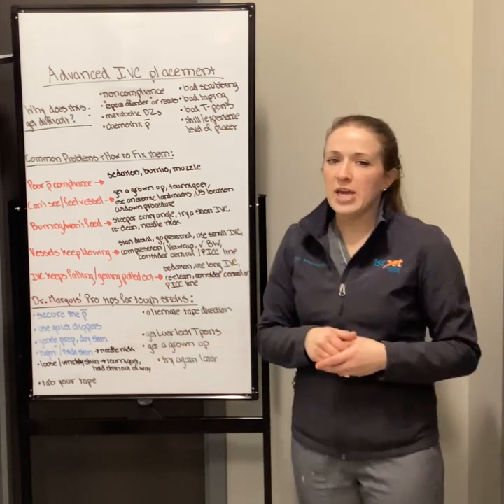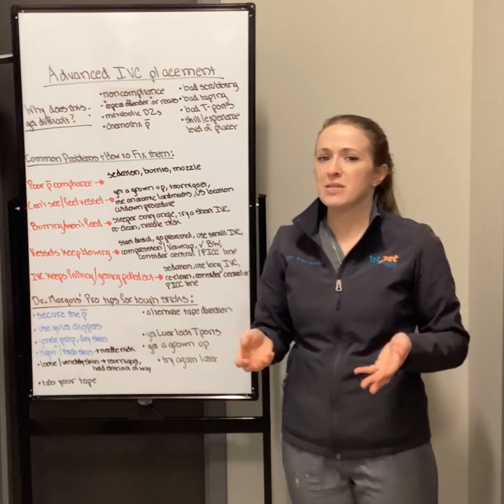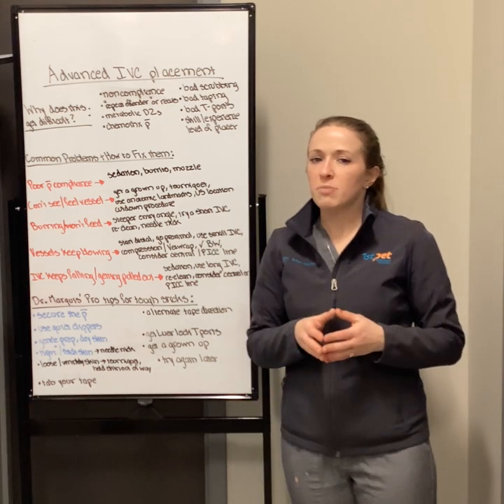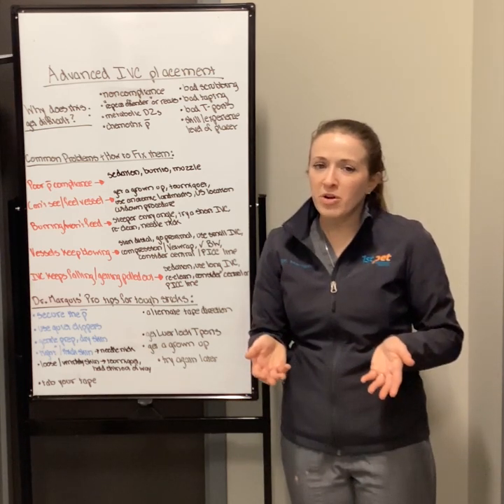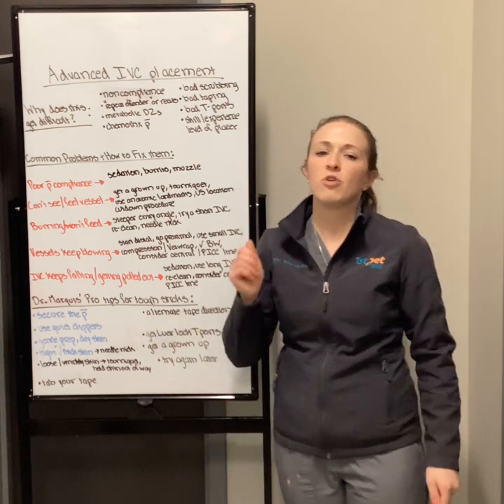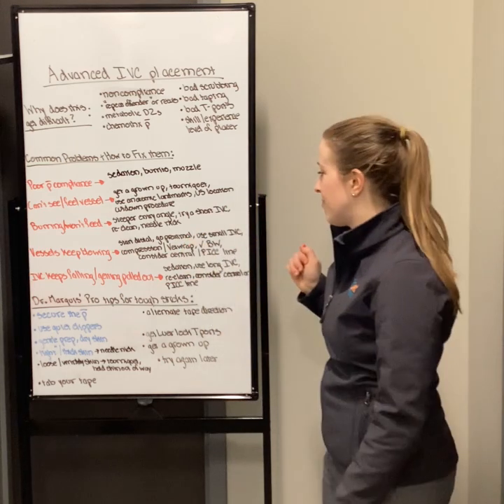Use a small IV catheter. If you have a patient where the vessels are blowing, maybe the animal has a metabolic disease, or the skin is fragile, try to use a smaller catheter, because I usually feel like they get into the smaller vessels a bit better, and when there is a hematoma, it's less profound than if you took a short 18 catheter and went hunting for the vein.